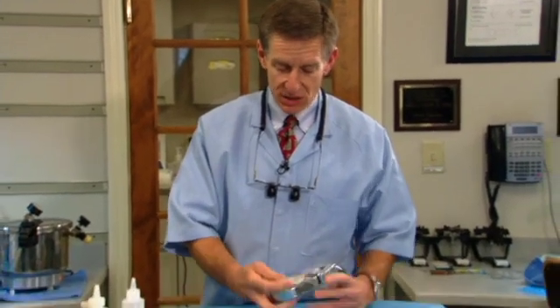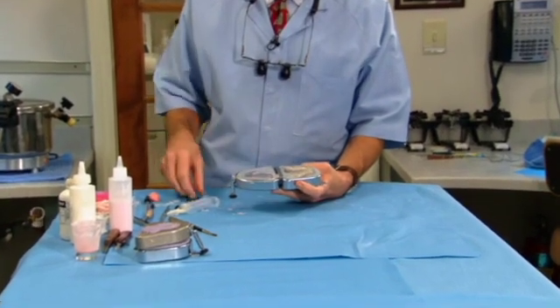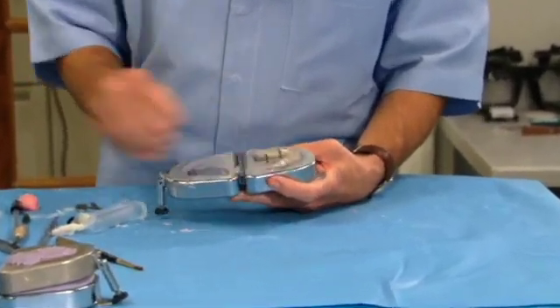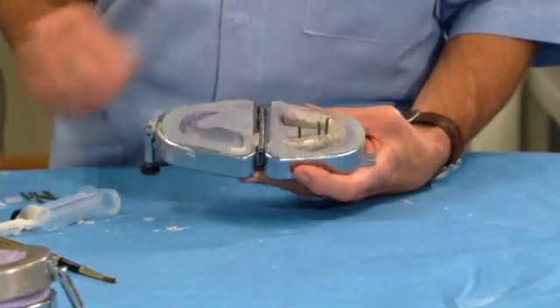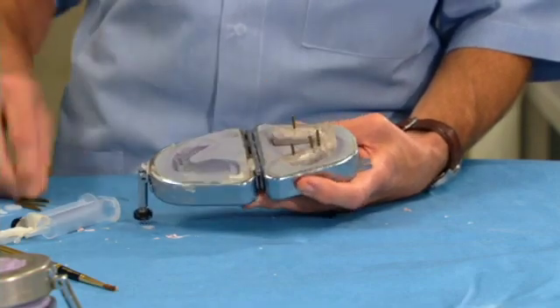Fits on the jig just like this. And then, using the putty, we determined where we would like to place our implants with a very highly technical piece of equipment. This is called coat hanger wire in Georgia.